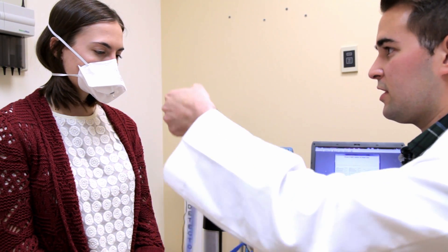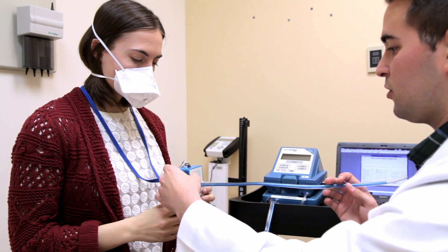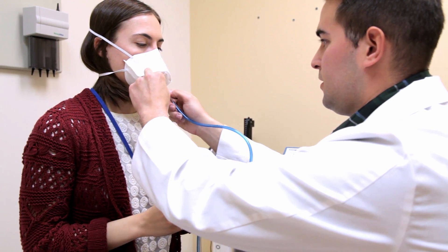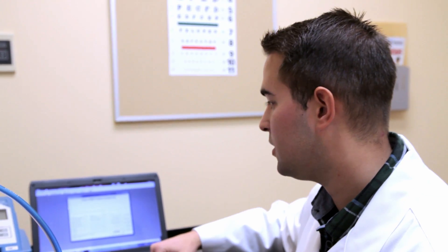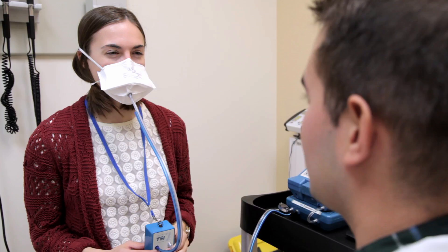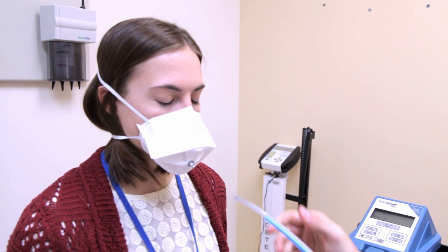In many workplaces, a respirator and a proper respirator fit test are the only components of an employee's respiratory protection program. For example, workers that may be exposed to asbestos are enrolled in an Intrinsic Analytics fibrogenic dust monitoring program. Our program also includes surveillance, spirometry, and chest x-rays after various levels of exposure. In addition, we often provide guidance to companies on the governmental reporting requirements that accompany such testing.